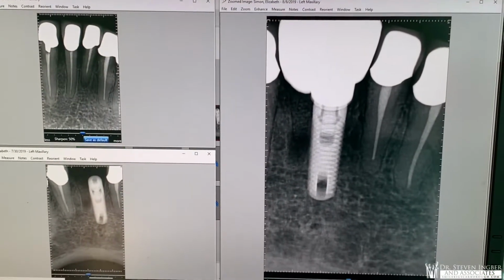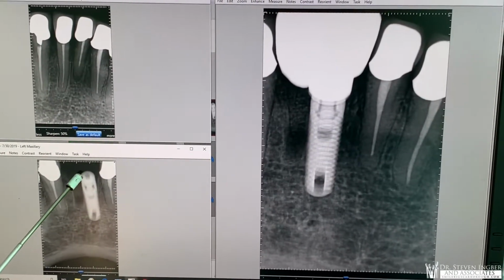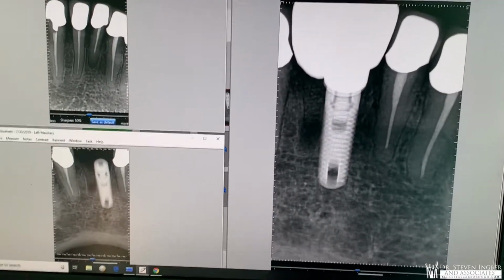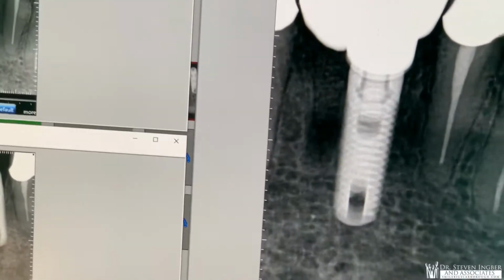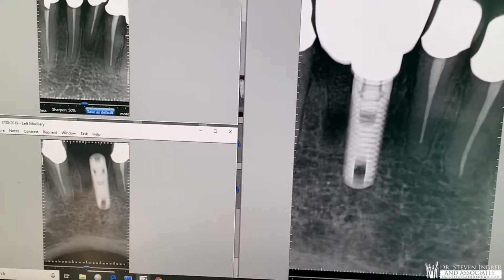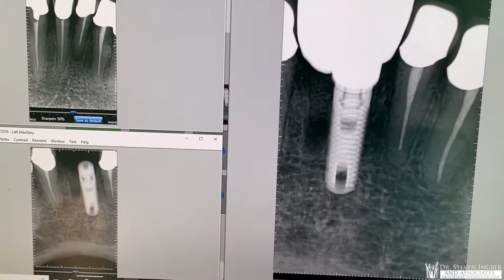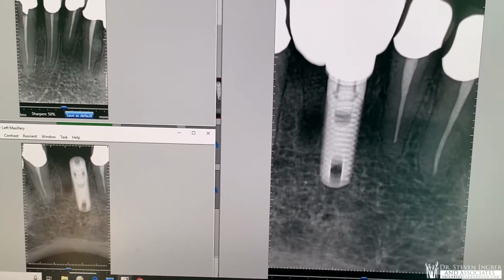Okay? So then traditionally what you do is you put a healing cap on here. You wait 3, 4, 5, 6 months, whatever the doctor wants to do, and then you let everything heal up. She wears a temporary denture that covers up this little space, that incidentally adds hundreds of dollars of cost. And at the end, it's basically not thrown away because we sterilize it and keep it for other patients to see, to give them examples of what could be done.